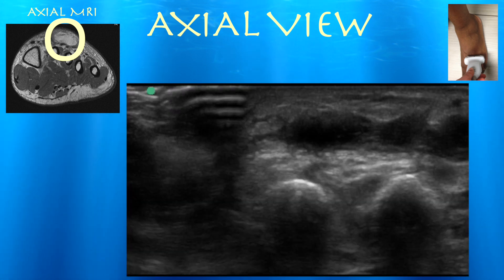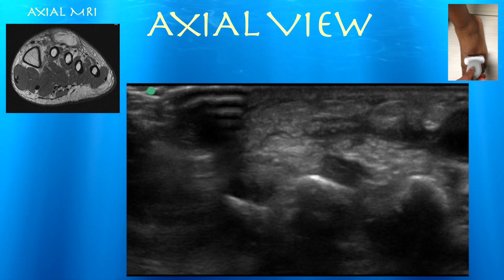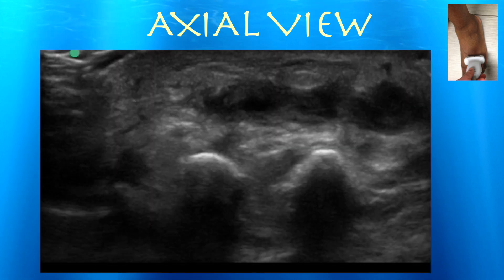Here we are in axial view, comparing it to his MRI. You can see the metatarsals and the extensor tendons right underneath the hematoma. This is where ultrasound is useful because we can avoid injuring these tendons during the aspiration and irrigation.